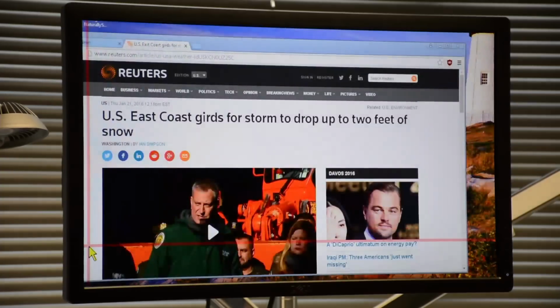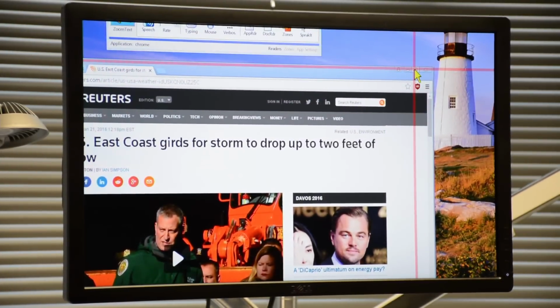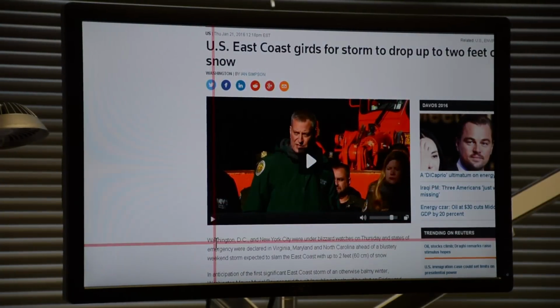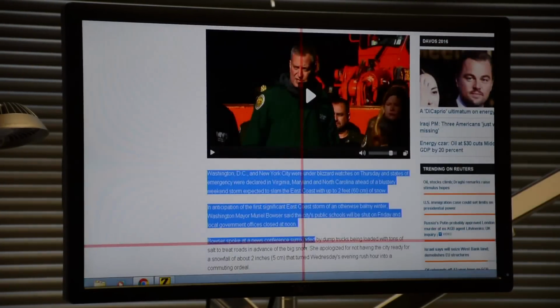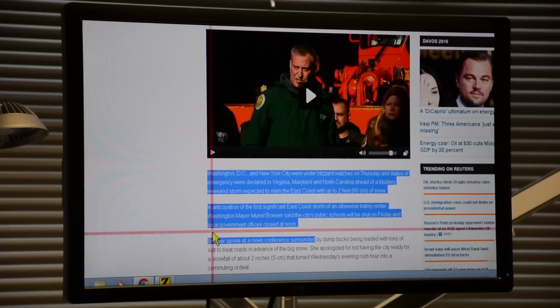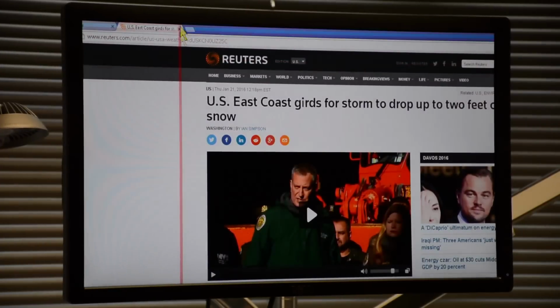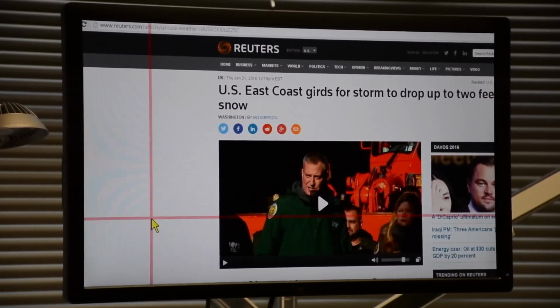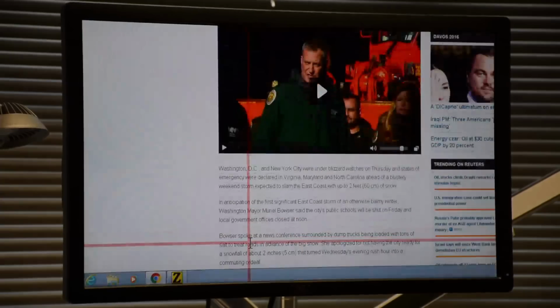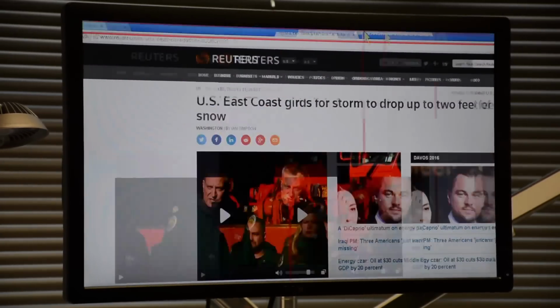I don't know if you'll be able to hear that, but ZoomText has app readers built in, so I can actually go into documents and have them read, if I can remember the command for it. So you could actually not only have the text zoomed in, but you could have ZoomText or Magic read text back to you as well.